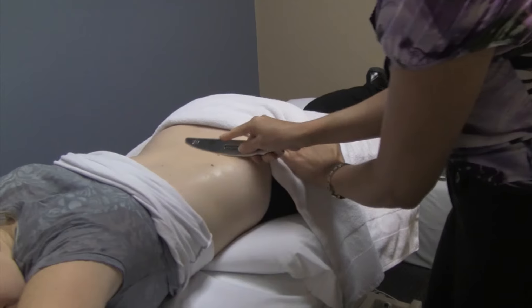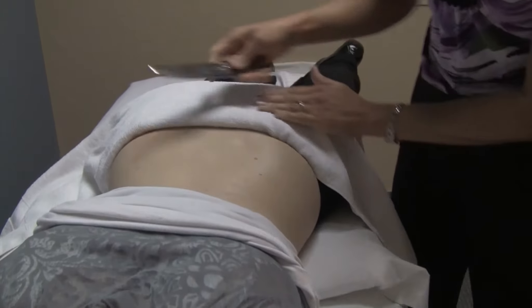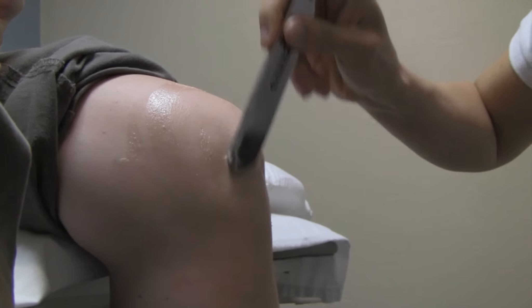The technique has been clinically proven to produce better outcomes for patients with Achilles tendonitis, knee pain, cervical spine pain, lumbar spine pain, among other areas in the body. It can be used to treat both acute, chronic, and post-surgical patients.